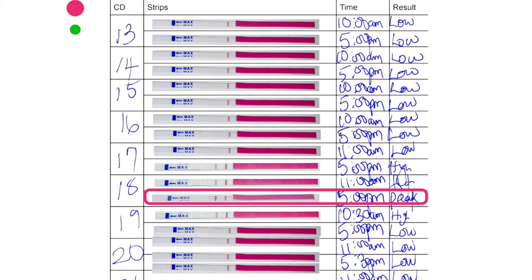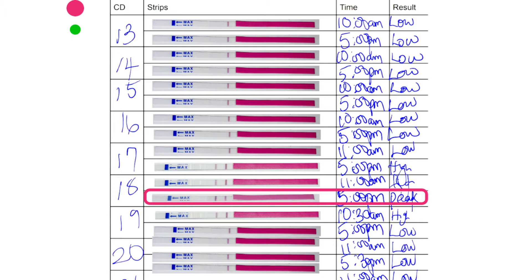Now, this lady has an average menstrual cycle length of 32 days. So she started testing on the 13th day and she was testing twice a day, morning and evening. So you can see from the morning of the 13th day up until the morning of the 17th day, she had low LH levels. And how do we know that? Because it was just one line showing the control line.